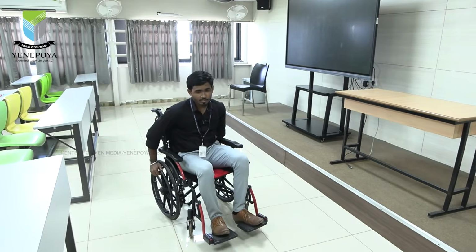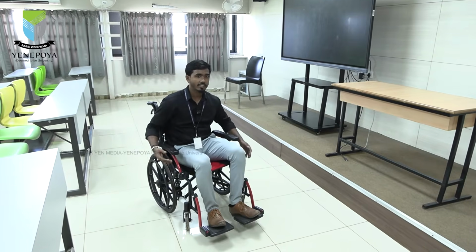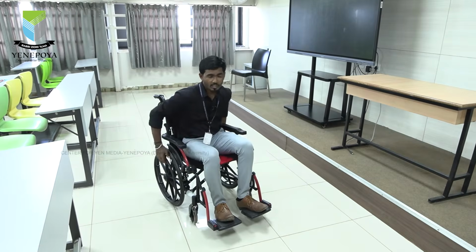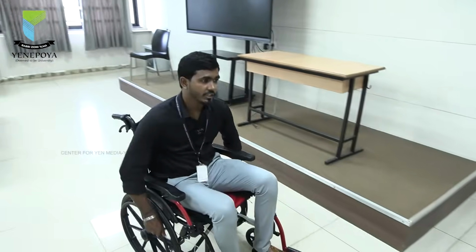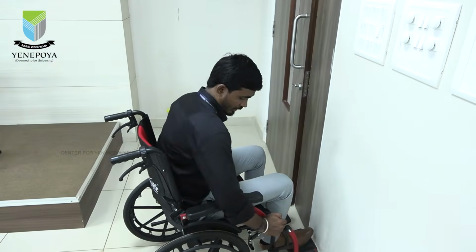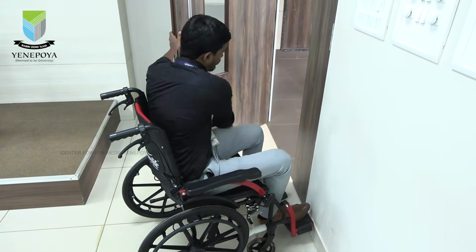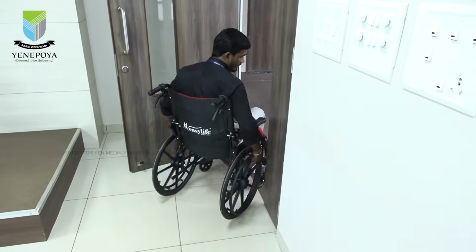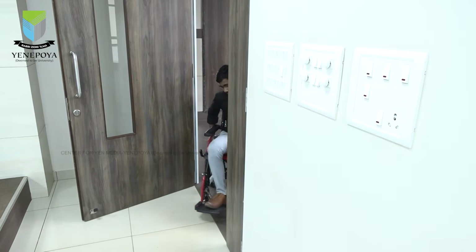The next thing is, the person is sitting here, but the person has to move from outside. I already told you, as an occupational therapist I want the person to perform movements independently, right? So I will go forward like this, and I will put the brake if I need. Then I will open the doors and go in. Afterwards it will come back.